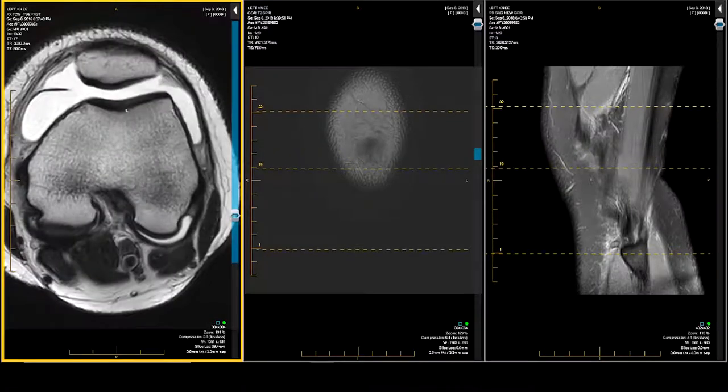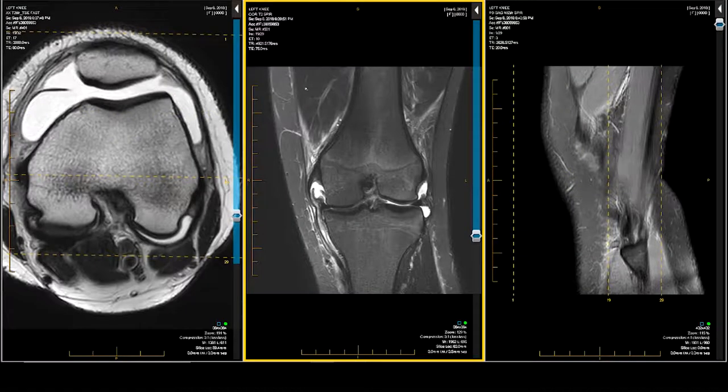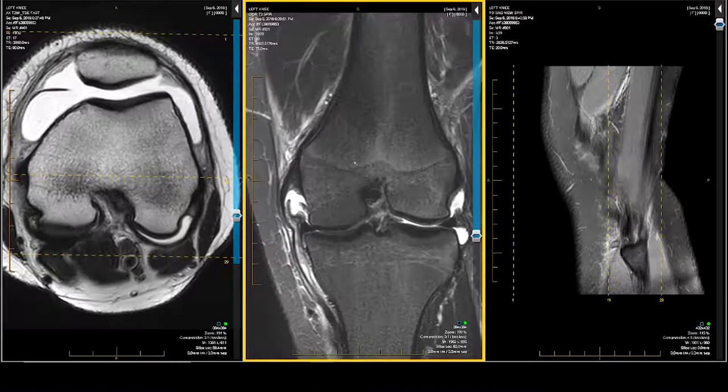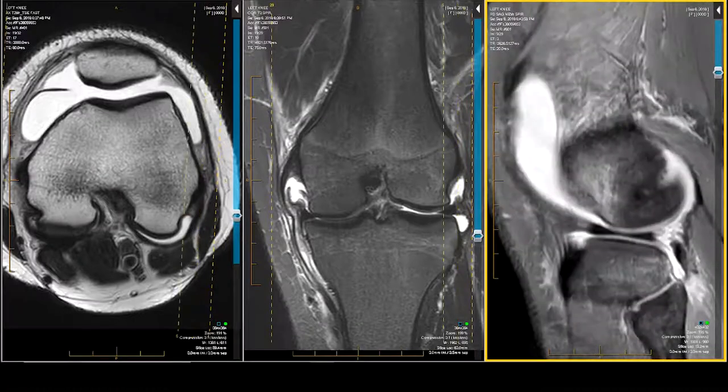T2 imaging is there to help you with injury dating — is it old, is it new, is it subacute? So it is not a detection sequence; it is a refinement sequence. The fat suppression T2 is pretty good, but not my first choice for detection. My first choice for detection is the proton density fat suppression, which is on the far right. This is my detection sequence.